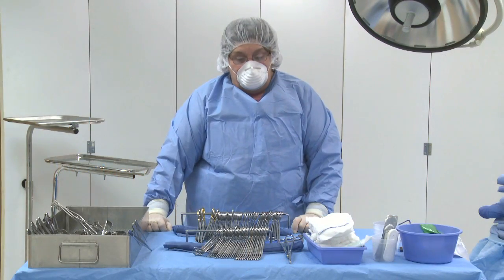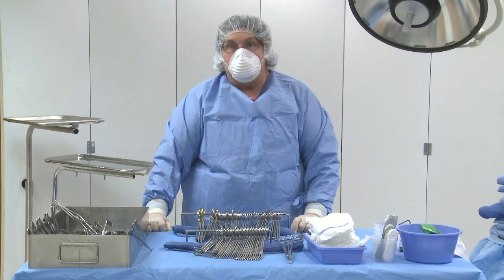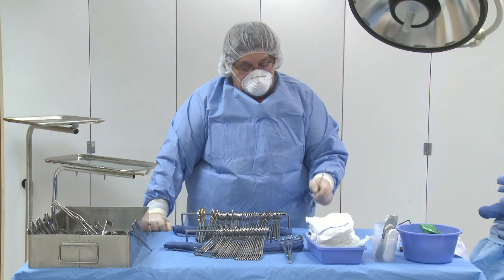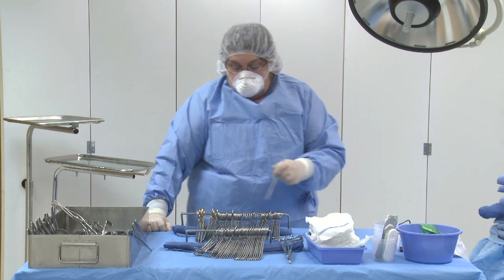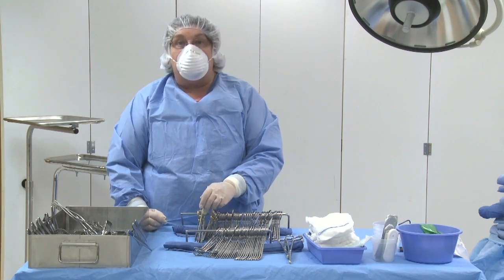Now that we've counted our soft goods and sharps, it's time to have our next lab lesson: counting instruments. When you count instruments, you take a knife handle or the groove director so that you can separate them out. Again, you don't count instruments alone — you count them with your circulating nurse. We're going to start with the long stringer first.